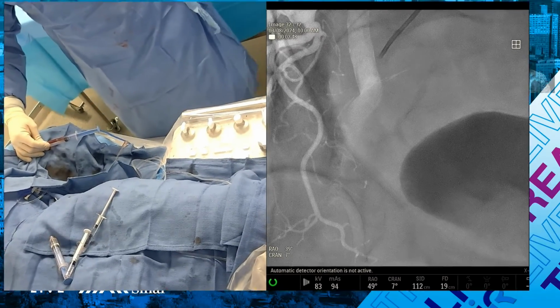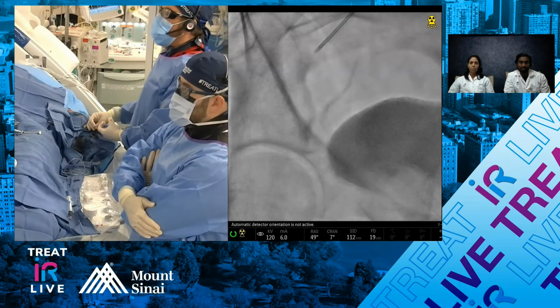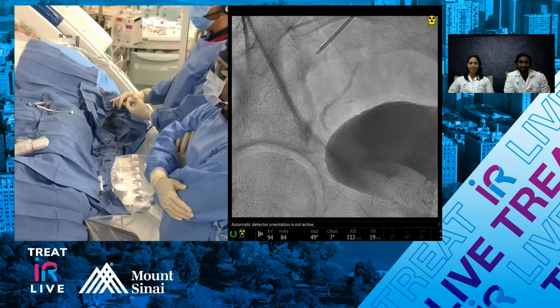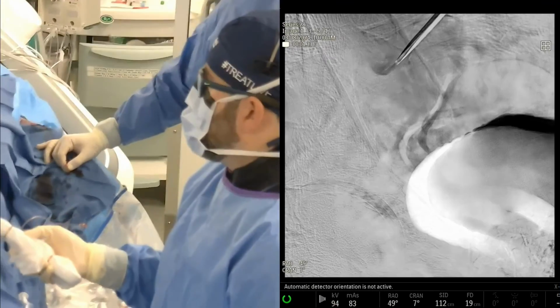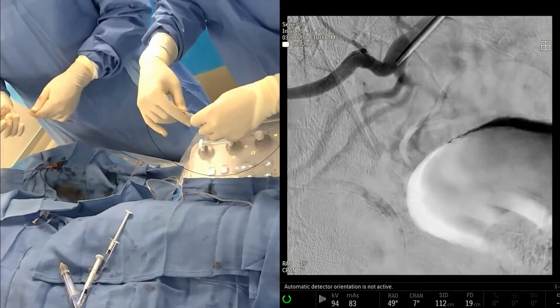We probably have 5 or 10 minutes here. Yeah, we have to keep 5 minutes to do this. You can see it there. All right, let's go. Vivian's giving us a challenge here. What's the curve look like? That looks pretty good. Pull the wire back.